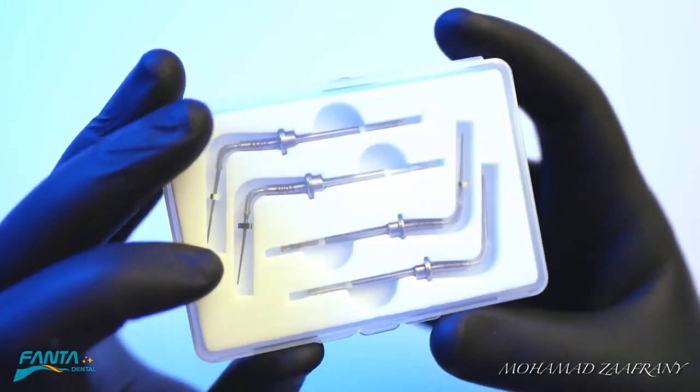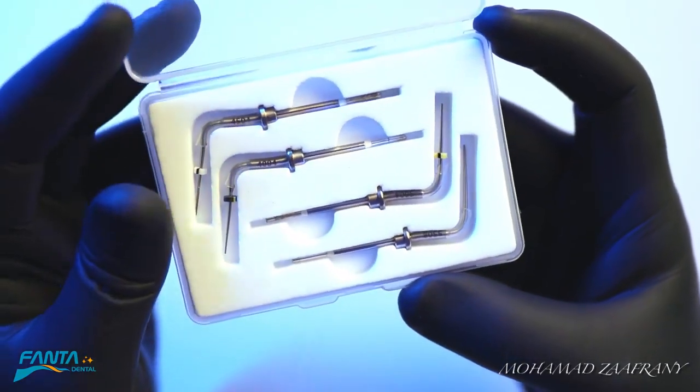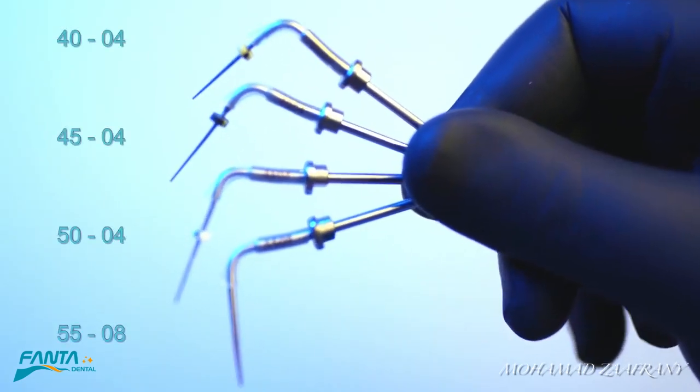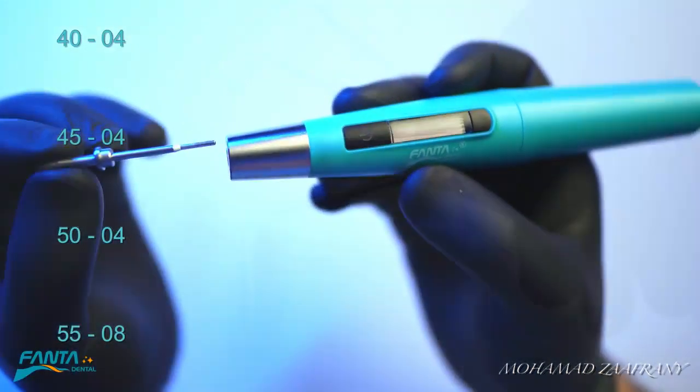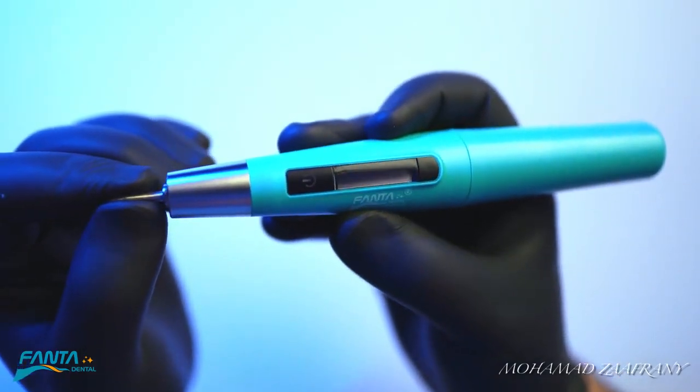In the box you'll find four heat carrier tips of four different sizes: 40-04, 45-04, 50-04, and 55-08. Simply, you can attach the tip to the main unit.